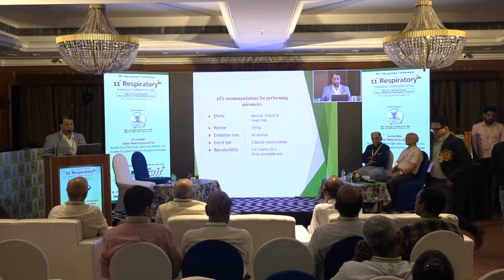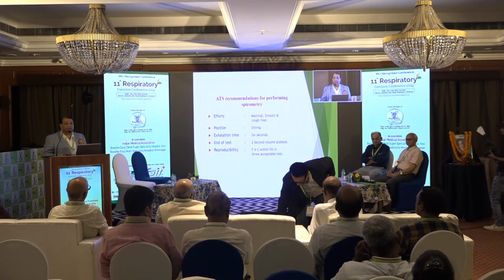This is a procedure based on ATS guidelines. We have to use a standard pattern for any spirometry test, because if spirometry is not done well, then the report will be false.